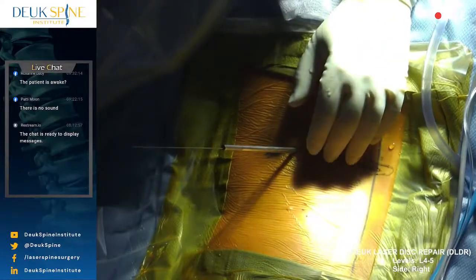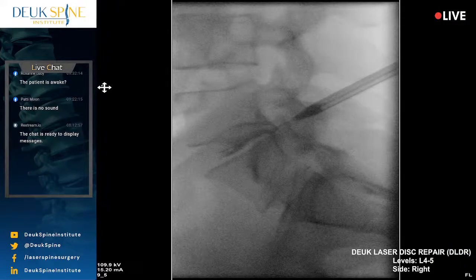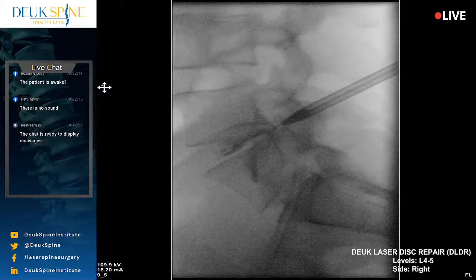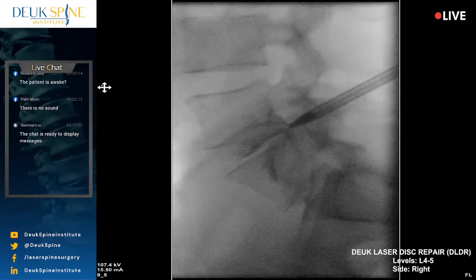Is it up yet or no? Oh, it's reading it. It has a tapered end. You can see it on the x-ray. It actually spreads tissues rather than cuts them. So we're not cutting anything. We're just spreading apart. And when we're done, those tissues will come back together just like normal, without any permanent damage to his body. The only permanent thing is going to be the little scar right here.